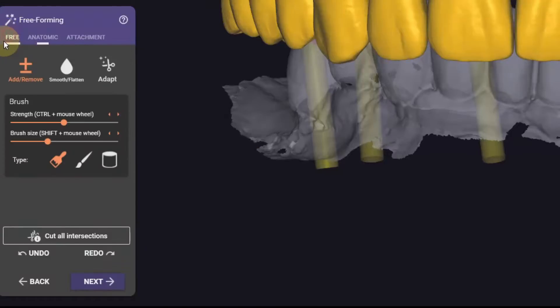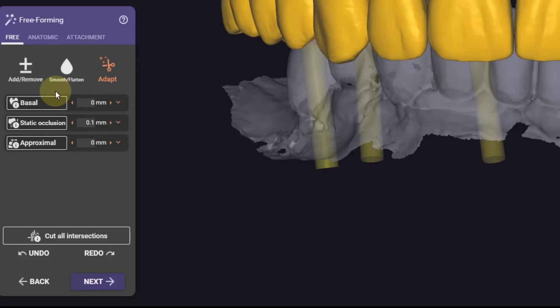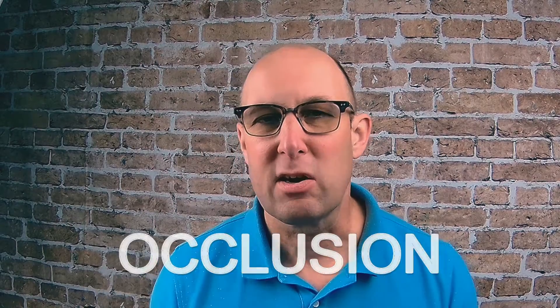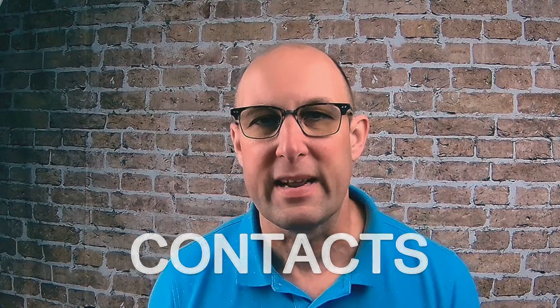I would use angular screw channels and could adjust those under the advanced tab. In free form I'm going to try to adjust to the perfect shape — that means cutting to the gingival, adjusting the occlusion and defining the proximal contact.